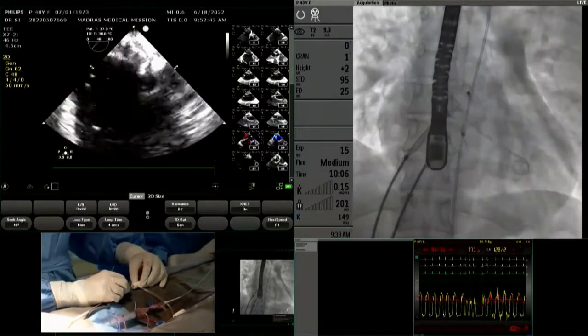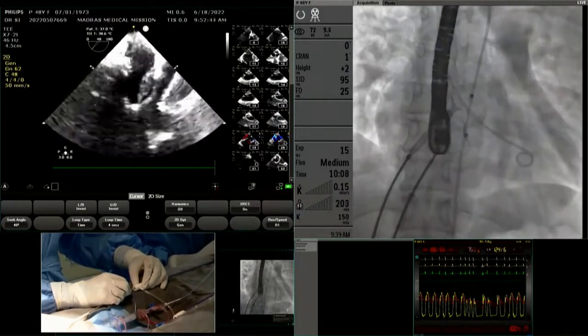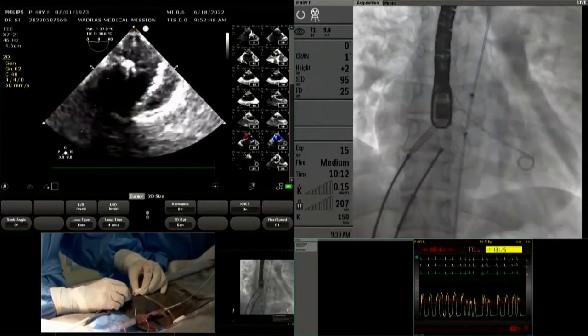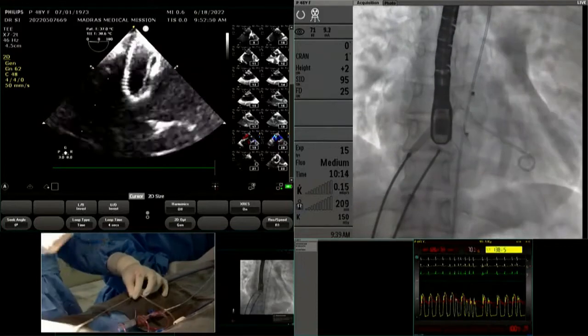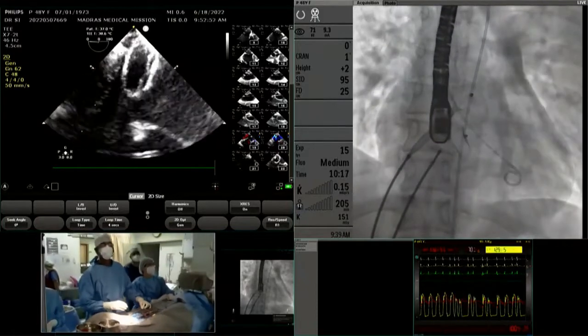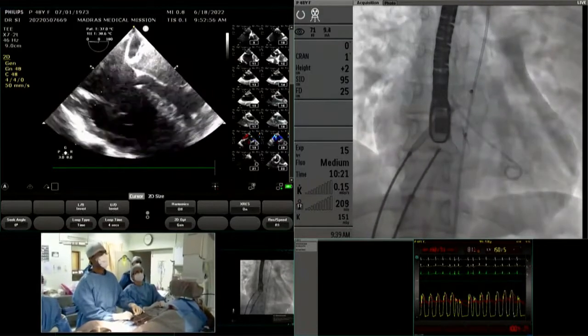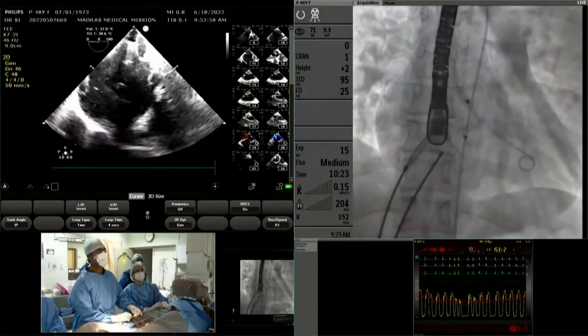Okay, now show me. I'm coming for the next device. Go to 0 degree. So the LA disc, make it anterior, so superior, that is the 24 device, is being deployed in the LA and then catching the disc, sandwiching that.